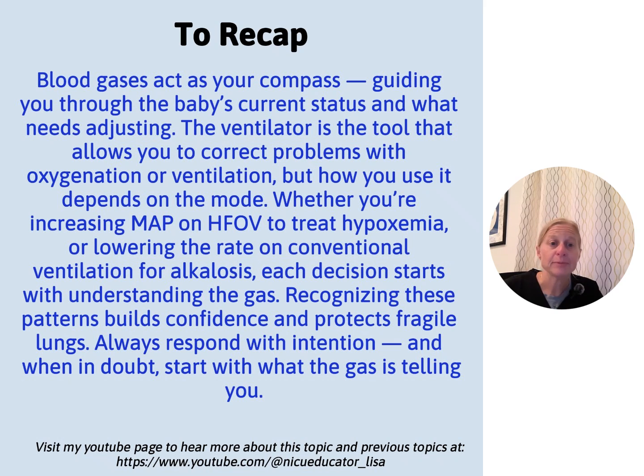Looking at your MAP on your high frequency oscillator for hypoxemia, lowering your rate on your conventional ventilator, knowing what your jet is doing with the passive exhalation, that the jet really works to get to the alveoli level, and that's why you're going to see a PEEP going on there, recognizing that our conventional ventilator may need higher pressures while your oscillator has active exhalation with the piston, which you can see in there in the little drum.